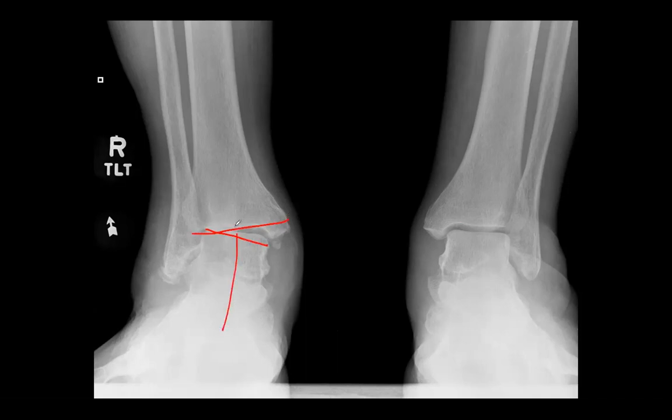So you are correct in that regard, but what's the classification for a flat foot? It was Johnson Strom. Right, and with the Meyerson addition, so we talk about stage 4 is specifically what? That's when you start getting more ankle and deltoid issues. Correct. So you have ankle valgus here, just like you said, and you can see the talus is really abutting, and you get maybe some of the calcaneus coming up down here. So this person might have subfibular impingement, but they definitely have a valgus ankle. So if you saw this alone, you could say that it's flat foot PTD stage 4. Okay. Good.